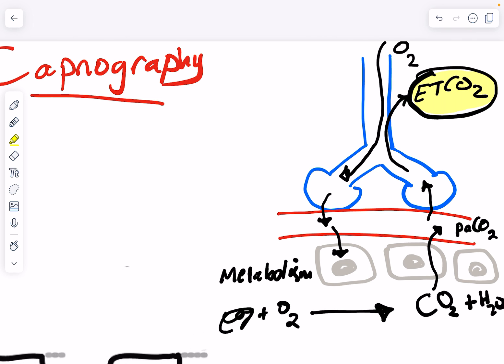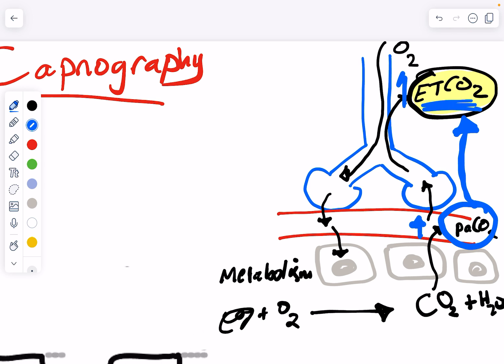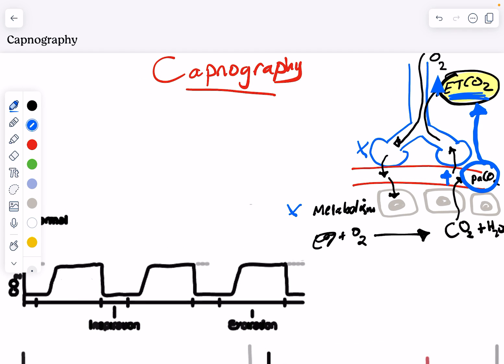You see, it's a reflection of so much going on. It means this patient is alive. The patient has breathed in oxygen. The cells have used it and have used aerobic metabolism to bring out CO2. You can also see that the arterial CO2 directly correlates with end tidal CO2 because it's exhaled into end tidal CO2. So the higher the arterial CO2, the higher the end tidal CO2 and vice versa. And any condition that affects metabolism or gas exchange will affect end tidal CO2.